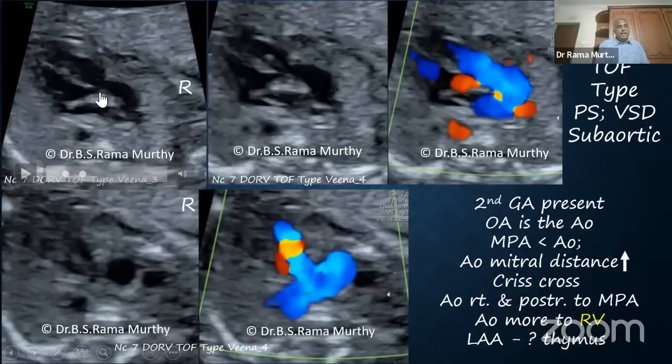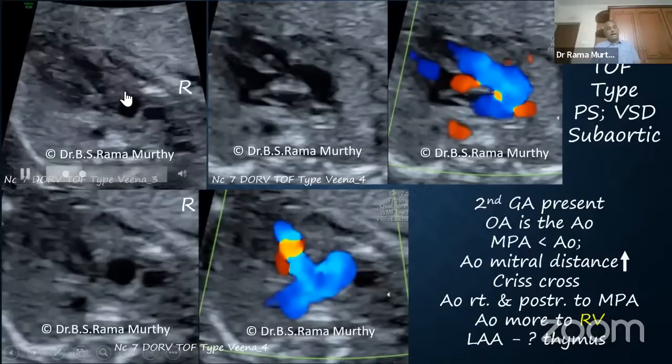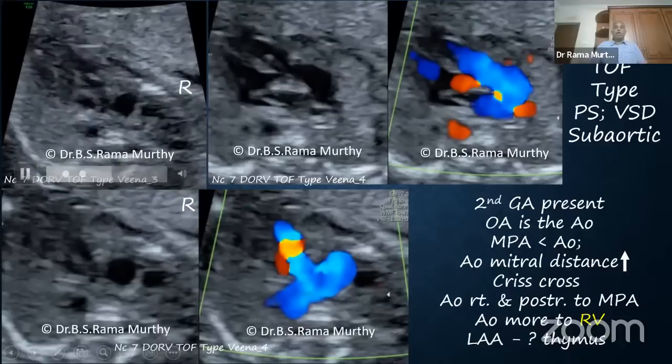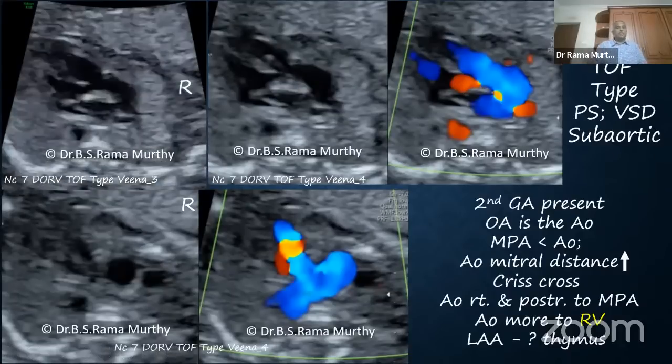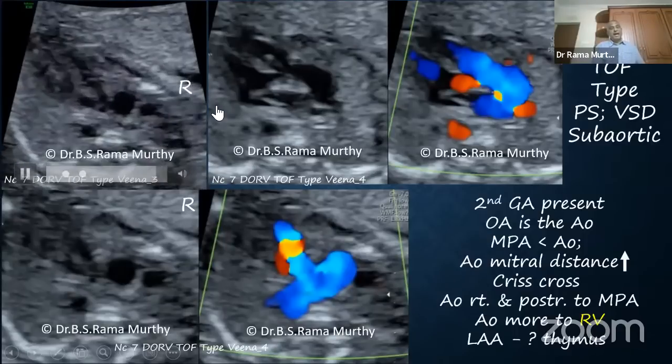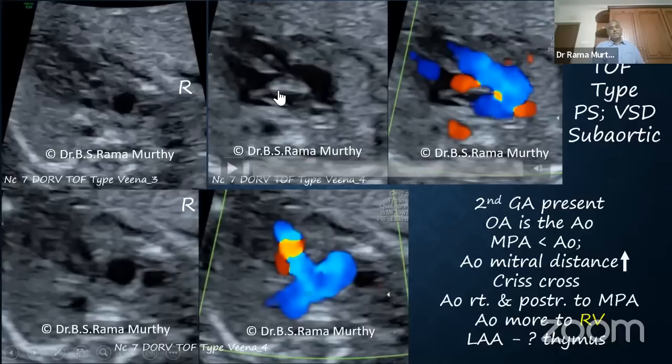The overriding aorta. Is it more committed to the left ventricle, posterior ventricle, that is left ventricle, or the anterior ventricle, this is right ventricle? Clearly, you will agree with me that the aorta is more committed to the right than the left, and therefore more than half of the aorta and the full pulmonary artery arise from the right ventricle. Therefore, this is not TOF, this is DORV of the TOF type, of the tetralogy of Fallot type. And why is the pulmonary artery narrow? Because of stenosis. And where is the VSD? The VSD is under the aorta. So it's a subaortic VSD.